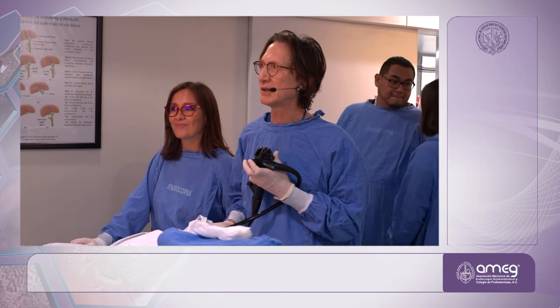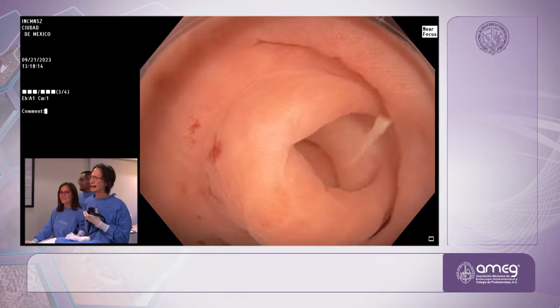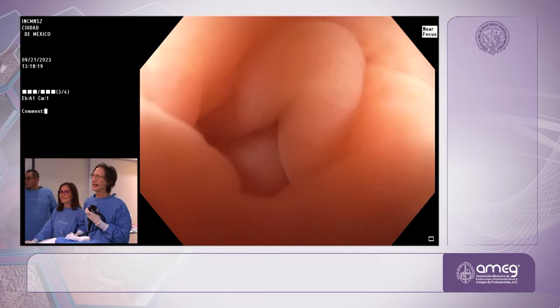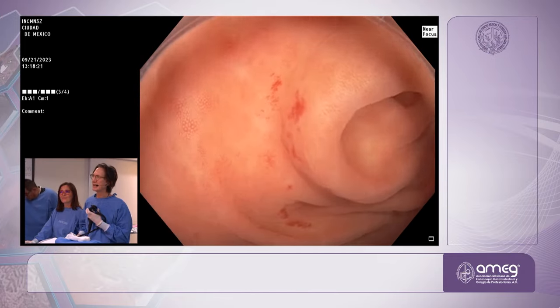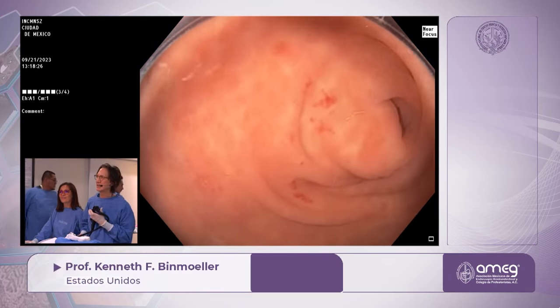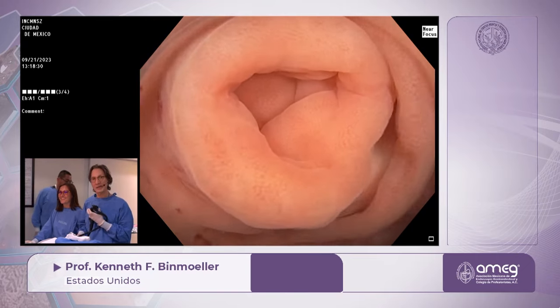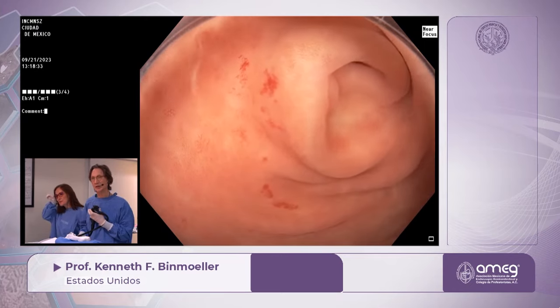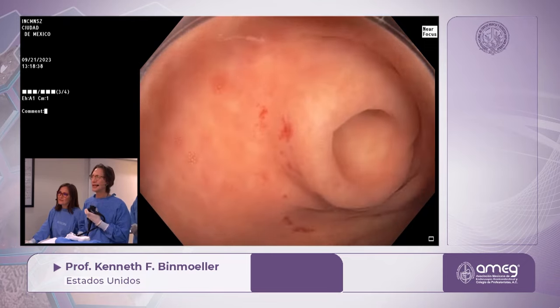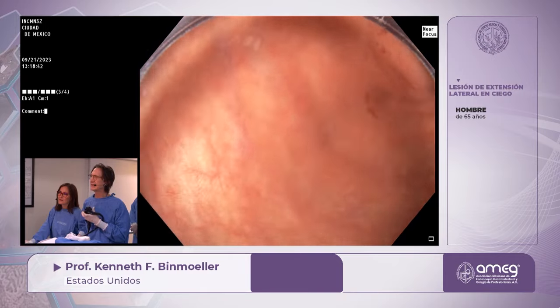Here we are in front of the appendiceal orifice, and with water infusion, you can see how I can interrogate the anatomy with water. So you can see I can move the folds around with the water irrigation, the water jet interrogation. And it's not uncommon to find SSAs, sessile serrated adenomas, in the appendiceal orifice. I've often discovered them. So I'll take a moment and look at that. And then I'm just circling back like this in the cecum.